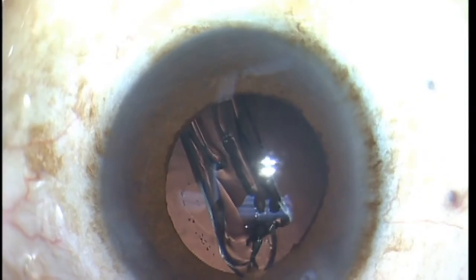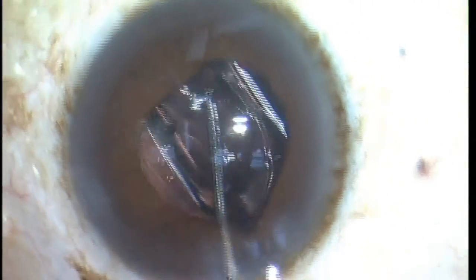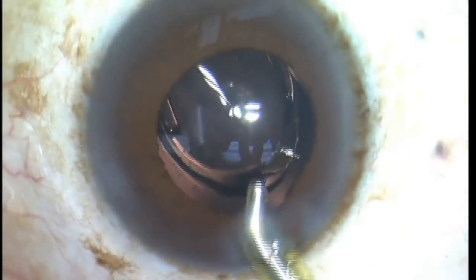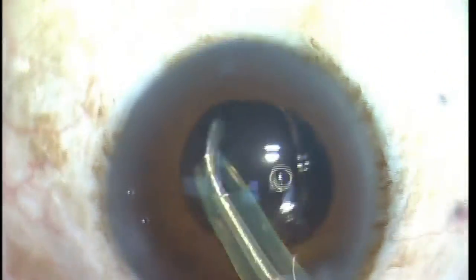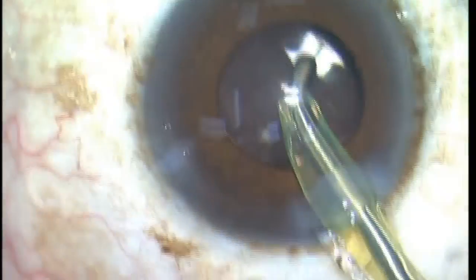Right there you saw me very cautiously removing the IA tip out because I didn't want that iris to prolapse through the main incision again. I used OVD to temporarily dilate the pupil so I could see to put the implant in, but look how much smaller the pupil is now. And as soon as I start IA and remove the OVD, the pupil is going to come down even more. Fortunately, I was able to visualize and get both haptics in the bag, and the surgery went uneventfully.